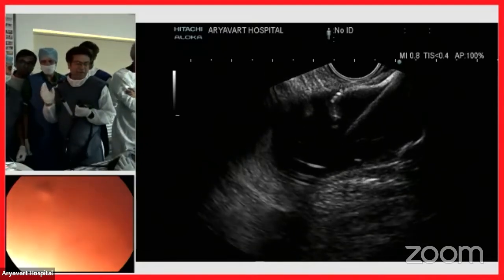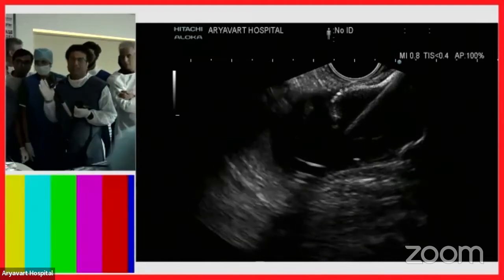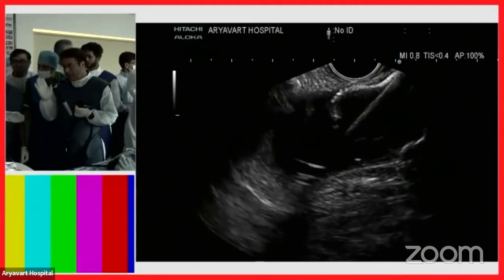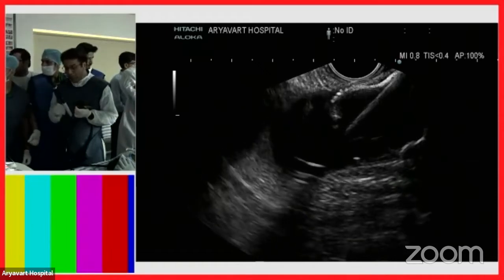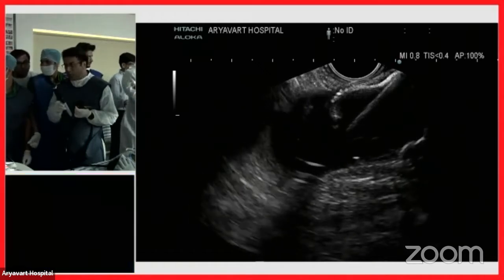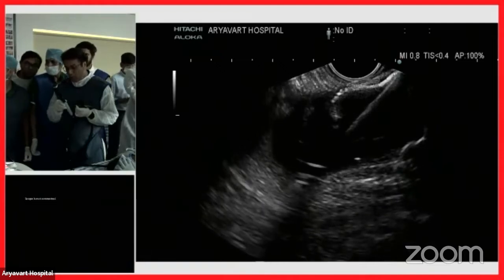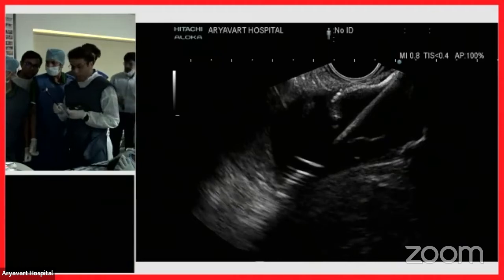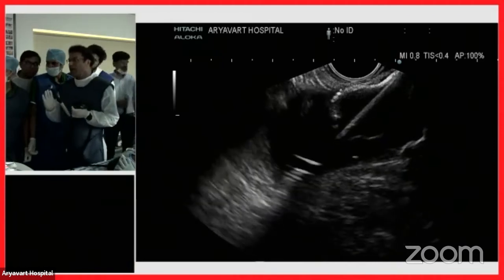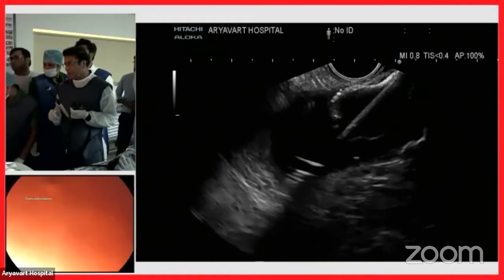What I have done, I have deployed the proximal flange, and now this flange is in the channel. So this is in the channel, the distal end is in the small bowel. And now I'll rotate my scope and push the sheath out so that this whole stent is deployed. Okay. So here I will resort to the endoscopic vision now. I need air.